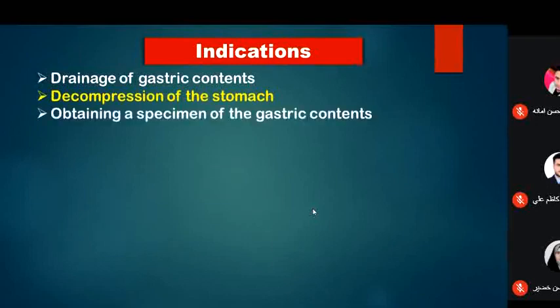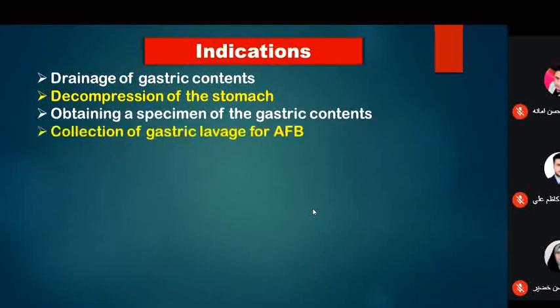Even air can come through the NG tube. Obtaining a specimen of the gastric contents. Collection of gastric lavage for AFB.